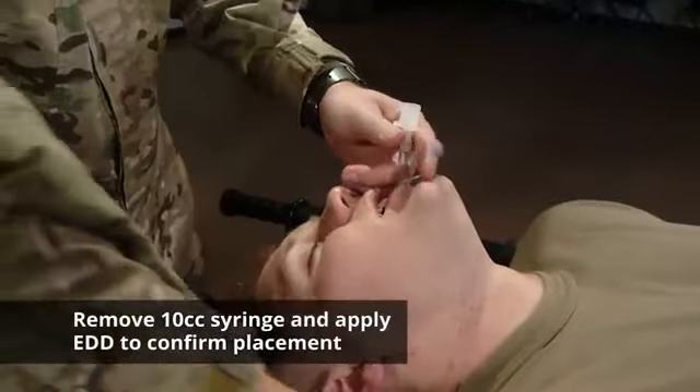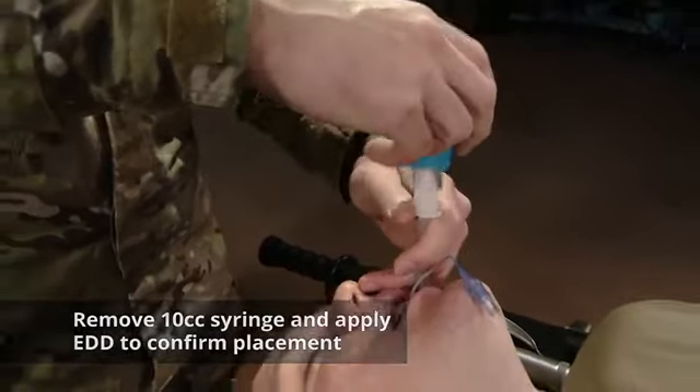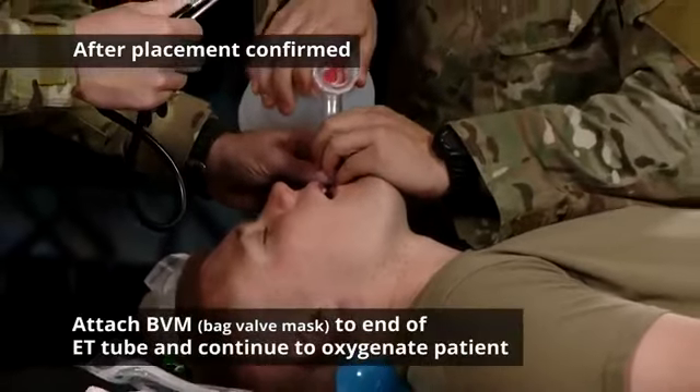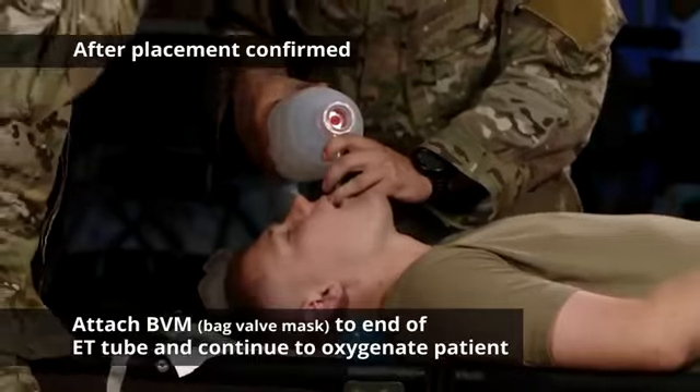Remove the 10 cc syringe and apply your EDD to confirm placement. After placement has been confirmed, have your helper attach the BVM to the end of the ET tube and continue to oxygenate your patient.